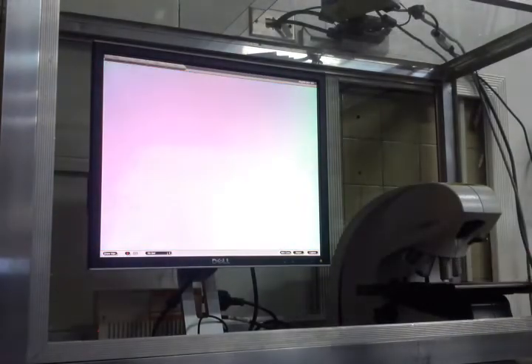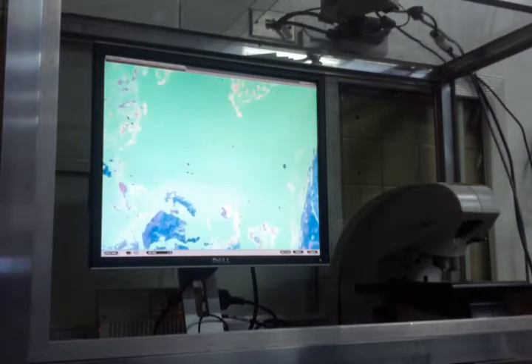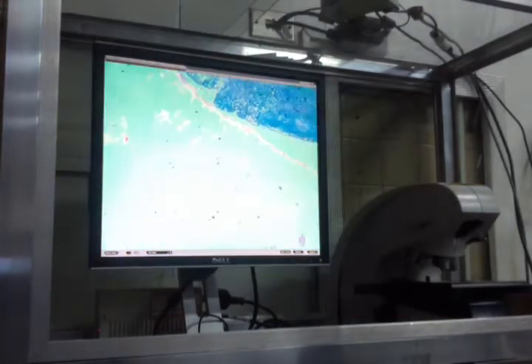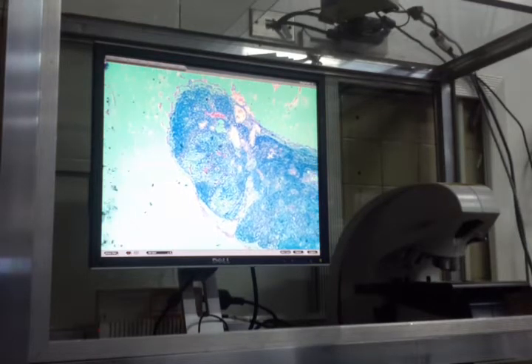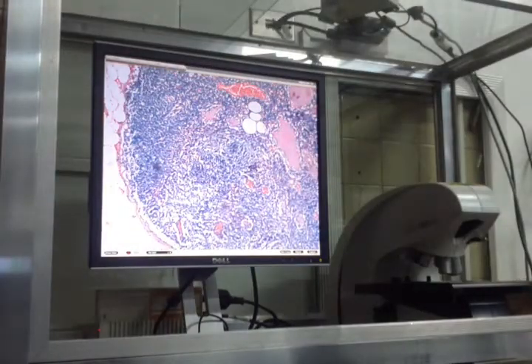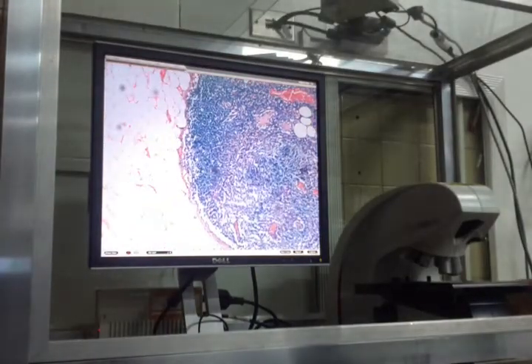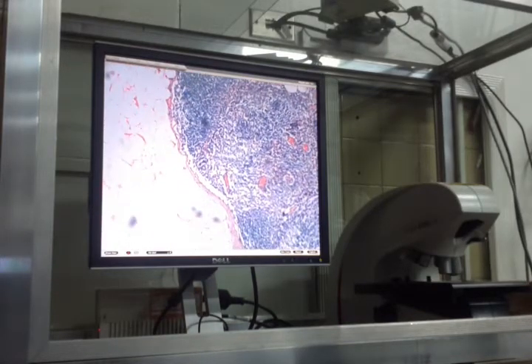Normal lymph node. Yung maliit dyan. Okay, what tissue is this? You have the subcapsular sinus, you have the capsule over here, you have the subcapsular sinus, cortex, medulla, medullary sinuses. Tissue, organ. That's a lymph node, okay?